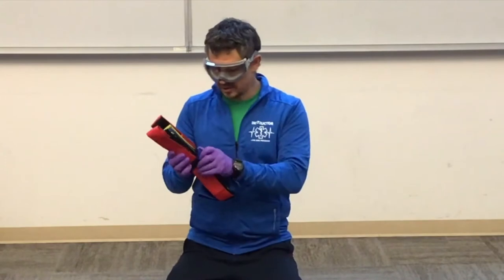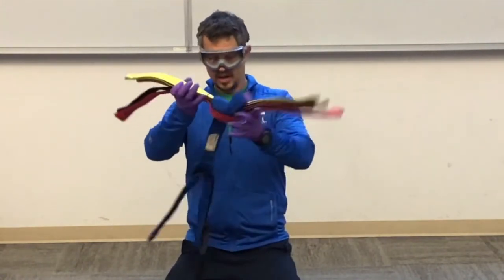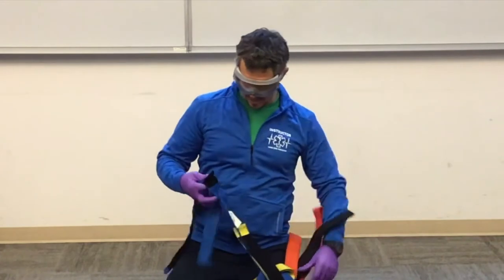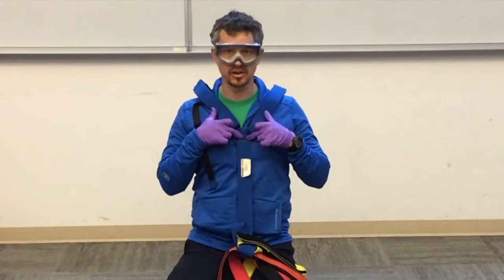Our spider strap is different than our buckle strap because it's all one piece. The top of our spider strap has this Y. This Y is designed to go over the shoulders down to the patient's sternum.